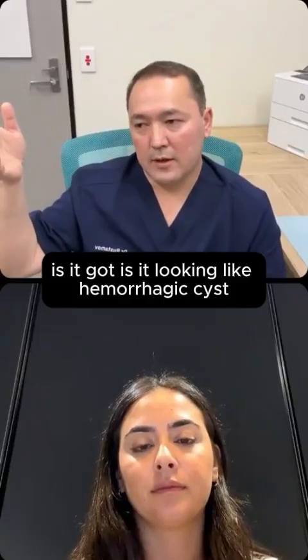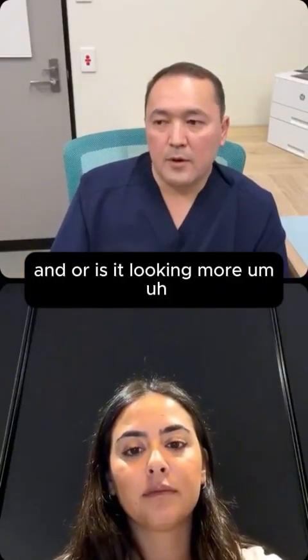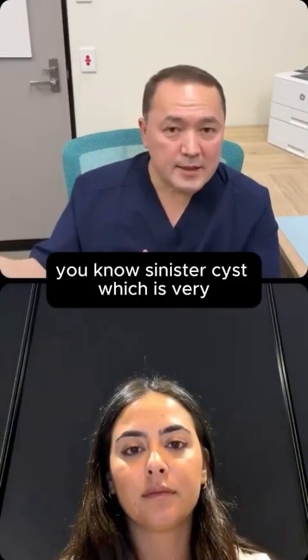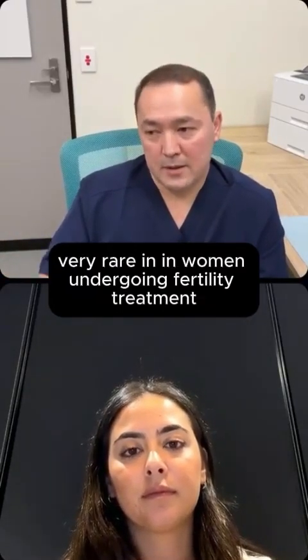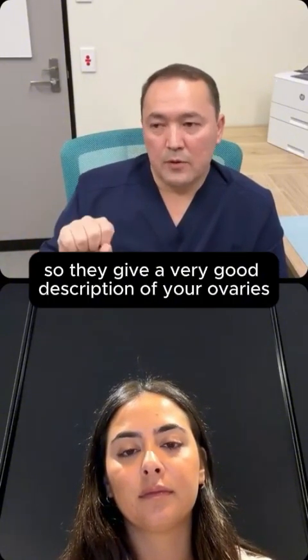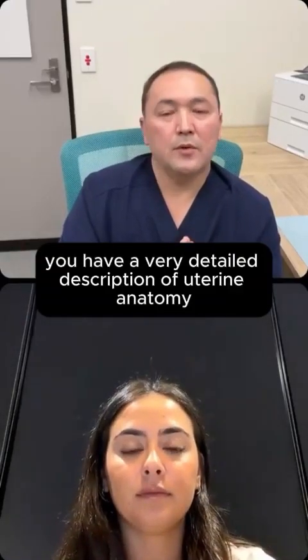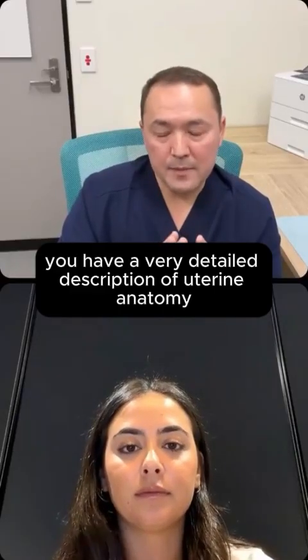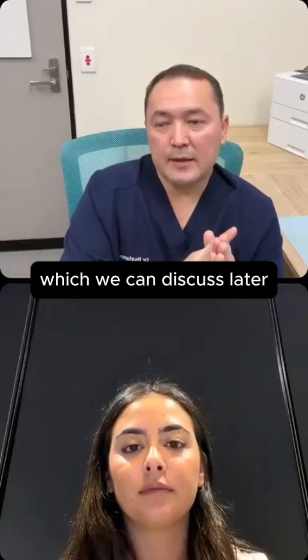Is it looking like a hemorrhagic cyst, endometriotic cyst, or dermoid cyst, or is it looking more like a sinister cyst, which is very, very rare in women undergoing fertility treatment, but it may happen. So they give a very good description of your ovaries, and also a very detailed description of uterine anatomy as part of the MUSA criteria, which we can discuss later.